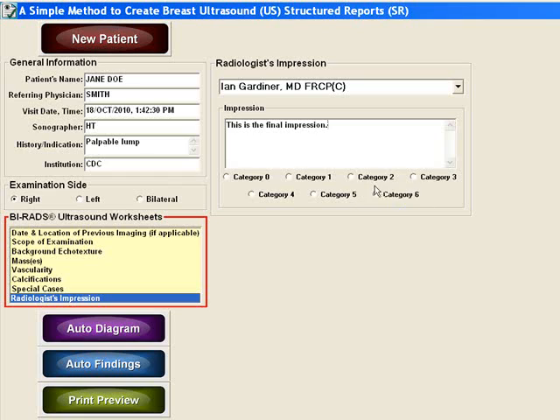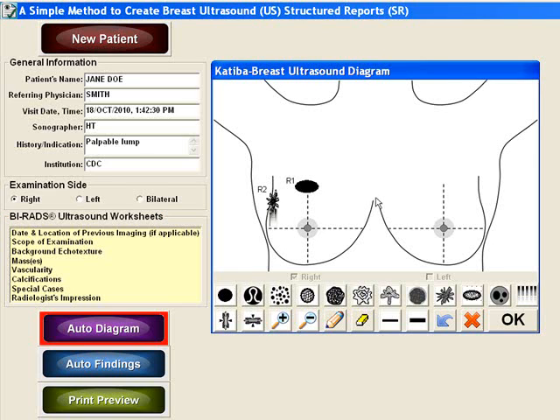Then select the appropriate BI-RADS category. The Auto Diagram button will automatically create a schematic drawing of the lesions. You can edit the drawing by clicking and dragging on the lesion. When you are happy with the changes, click OK.